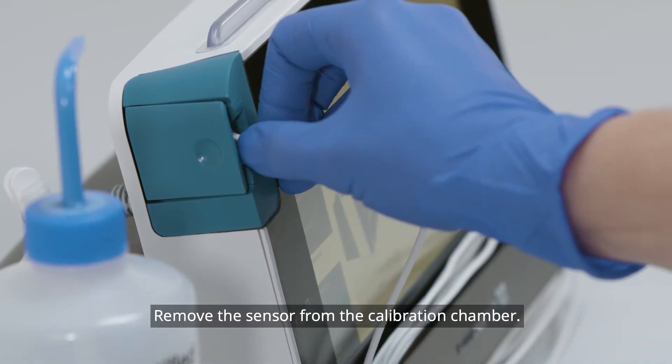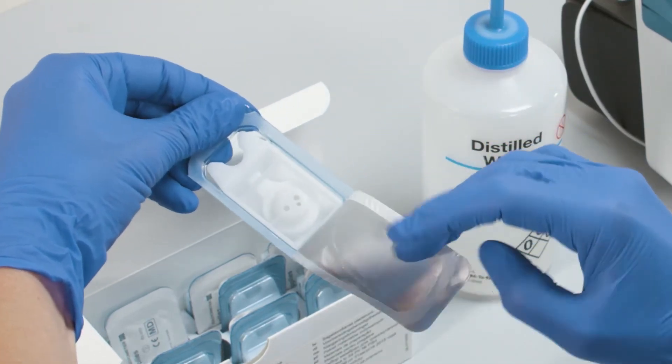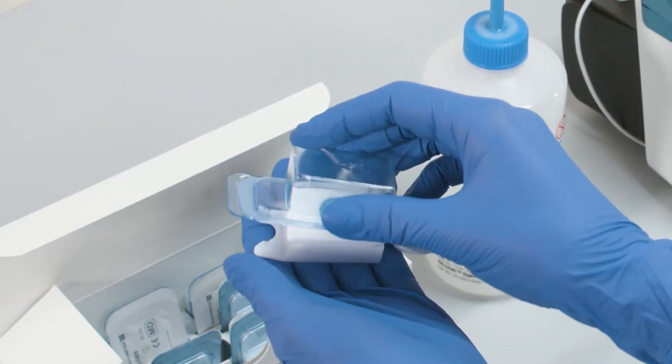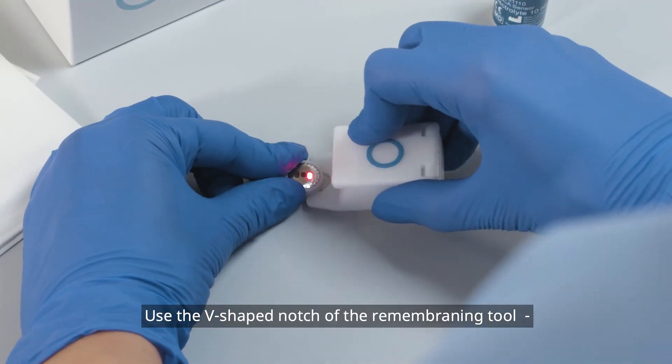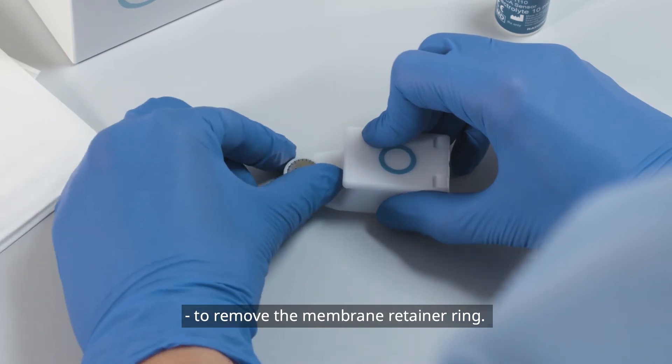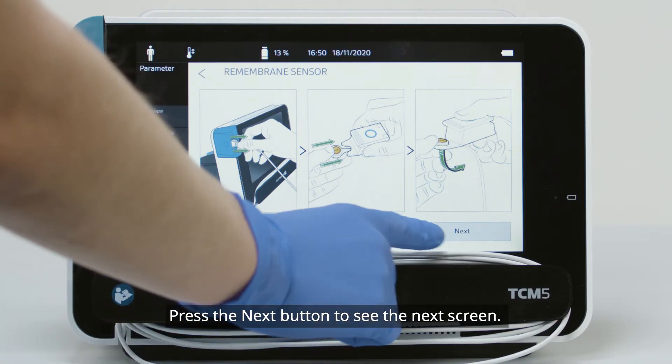Remove the sensor from the calibration chamber. Use the V-shaped notch of the re-membraning tool to remove the membrane retainer ring. Press the Next button to see the next screen.